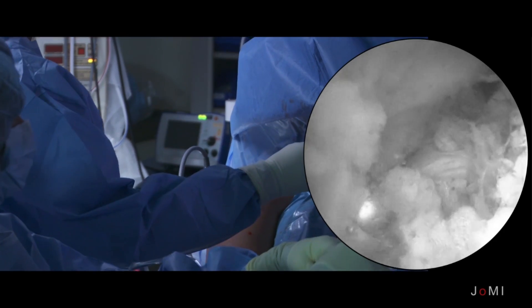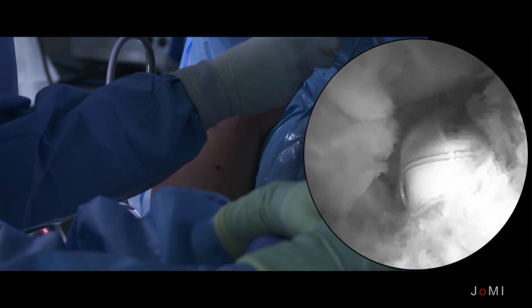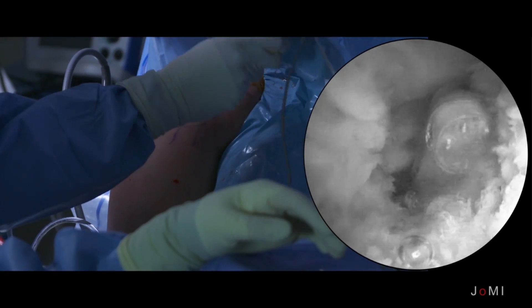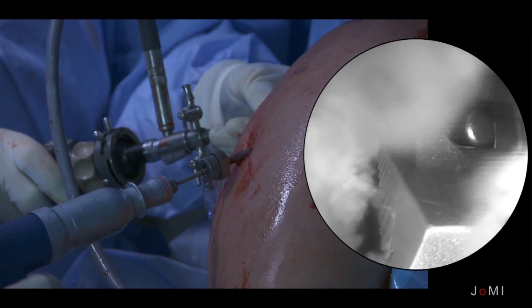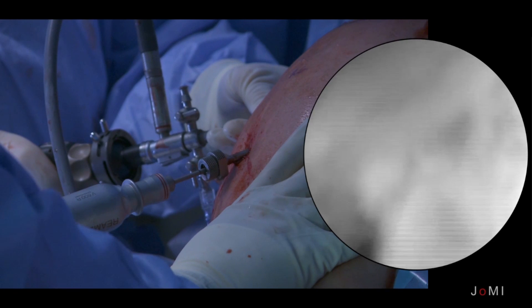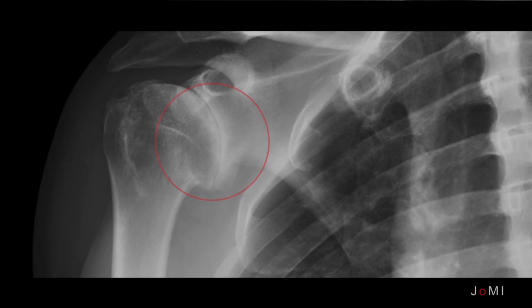Next, you're going to see that we take out the rotator interval and remove the biceps from the field — that gives us more working room. And then we'll start with the procedure where we begin to prepare the surfaces of the humeral head and the glenoid so that they can receive the graft. This is a patient that essentially has classic osteoarthritis of the shoulder, albeit at a young age.